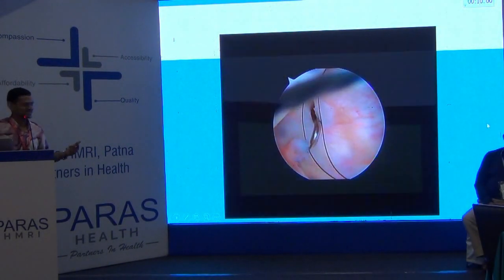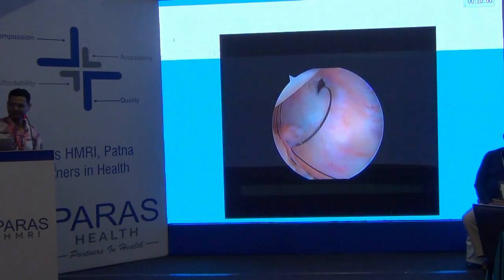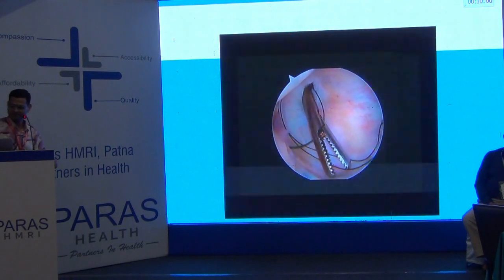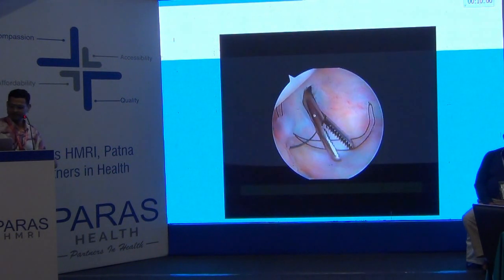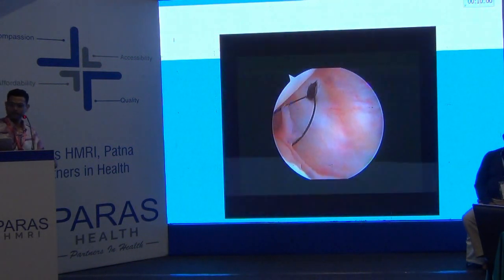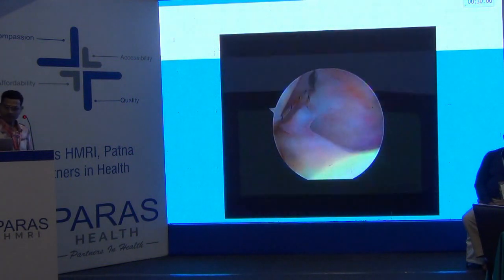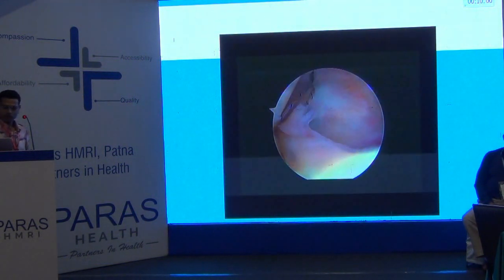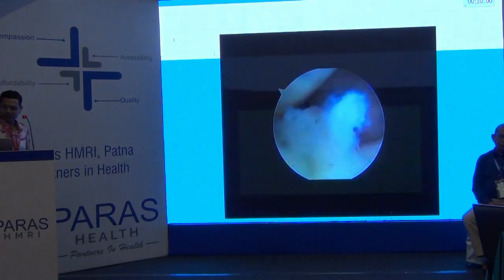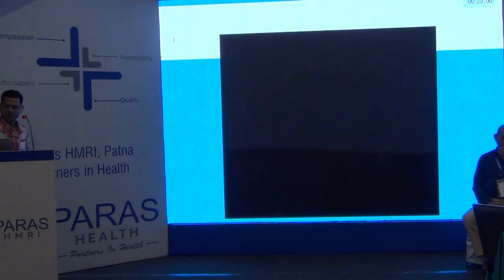The FiberWire is shuttled, and the sliding knot is taken, which is reinforced by three half hitches alternating.